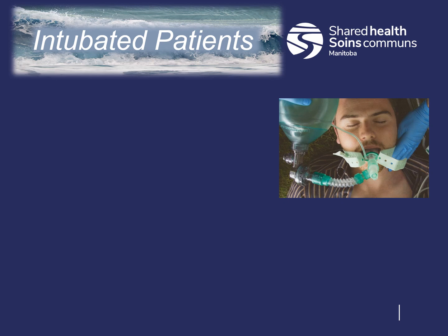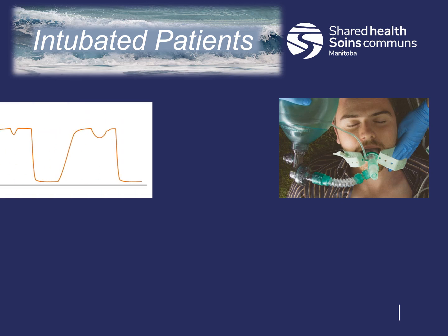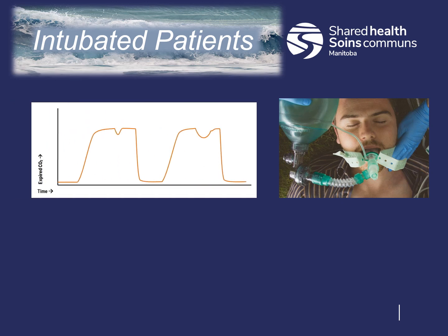While maintaining patients who are intubated, there are a couple of waveforms that we need to be watching for as well. The Curare cleft, which is seen in the alveolar plateau, is actually a patient making an attempt to breathe. So while ventilating a patient, if you see this, it means that you need to check your patient's breathing status. While the patient's feeble inspiratory efforts are there, some fresh gas is sucked into the tubing and goes past the capnometer, generating this pattern. We'll have to assess if the patient is ready to be extubated or if we need to provide some sedation.